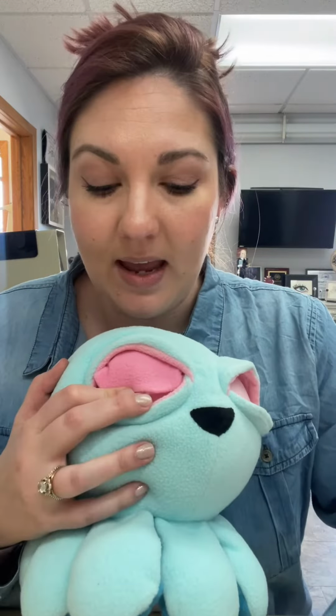We've talked a lot about it before, but when an implant is placed within the socket after the eye is removed, all four of the rectus muscles are attached, and then the tissue is closed up over the top of the implant, stays that way, and then we can put the prosthesis over the top.